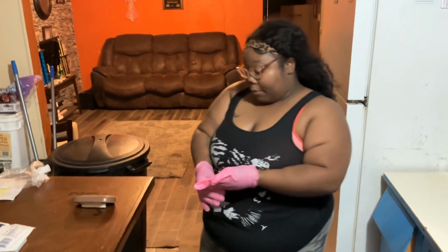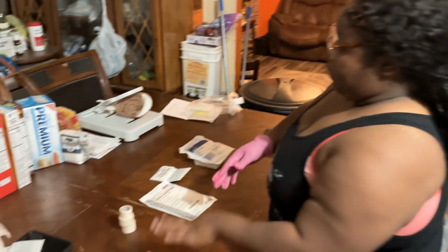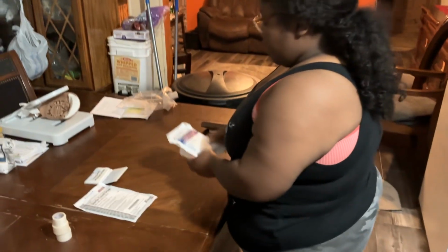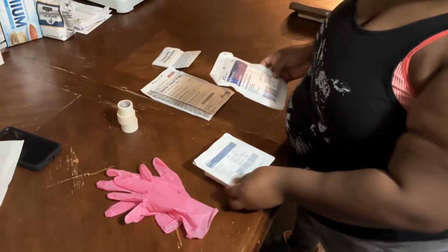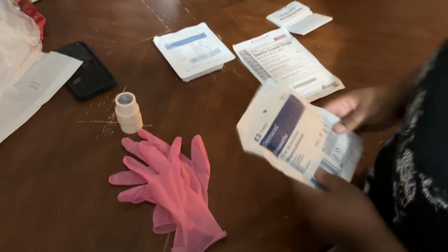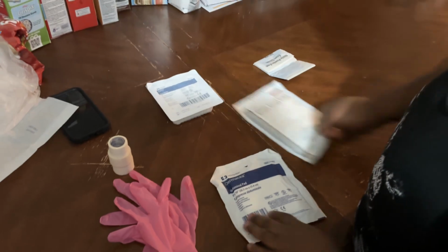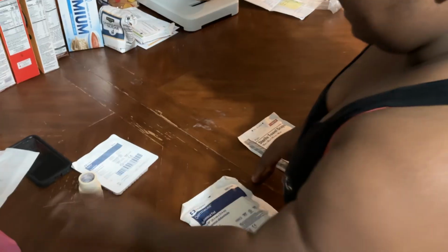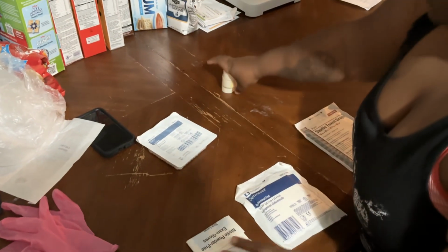Okay, now I'm going to step back. I will remove my gloves. I'm going to keep these because I'm going to need them for later. But in the real world, I would discard these gloves in the appropriate bin. Okay. Alright. I've already inspected my material. Everything's within date. So just going to get that over here and get it started. Those are my sterile gloves. That's my tape I'm going to need for the end.